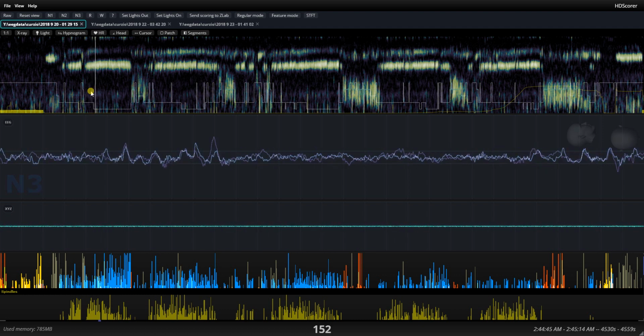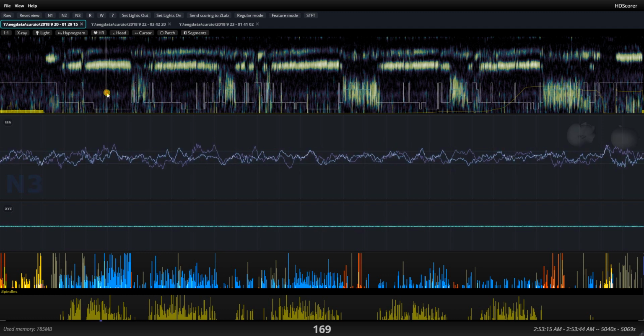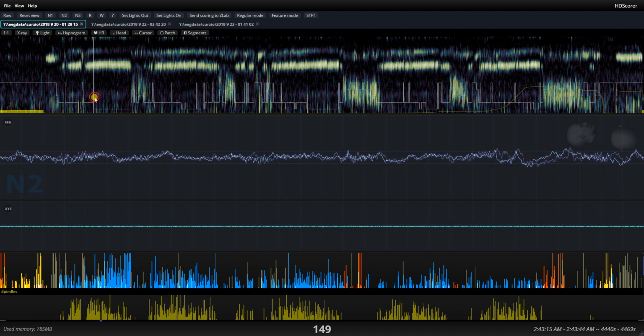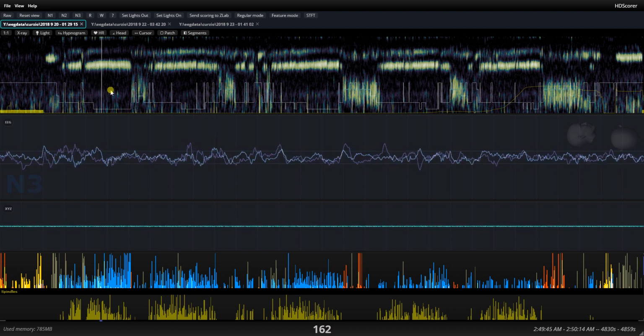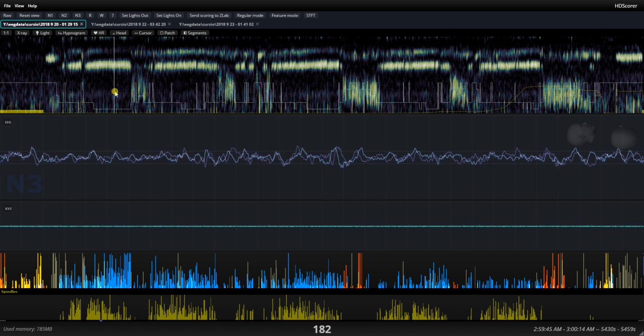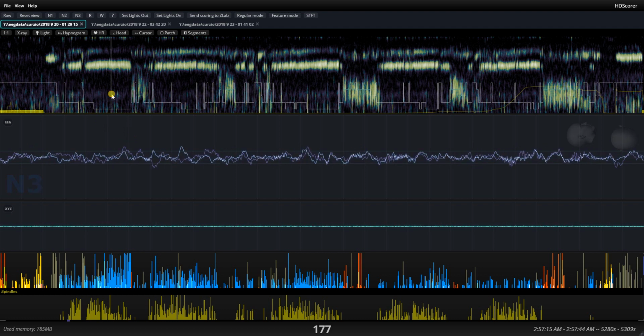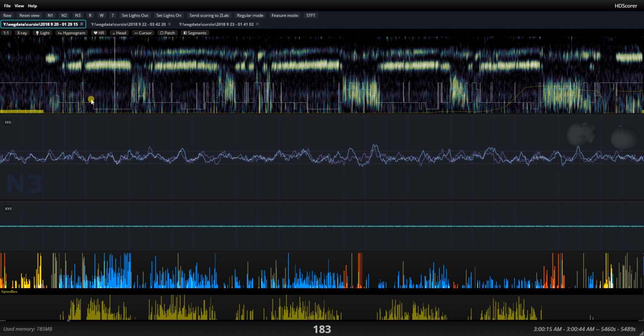That is to look through the epochs and then say, hey, I think it's getting much more intense right here, so this is what I'm going to use as my threshold for N3. Now, the other thing that I would like to check is, for example, I move towards a period that is guaranteed to be truly N3, usually around the center of the first sleep cycle, and I look at what the wave looks like. Then I recede to something that's guaranteed to be N2, which is the very beginning of the first sleep cycle, and I ask myself, do they look very different? And yes, they do look very different, so that's validated.